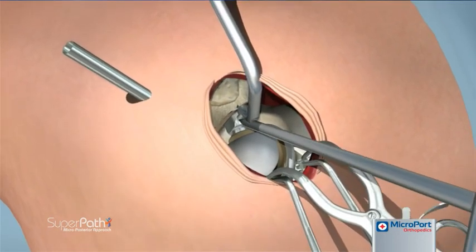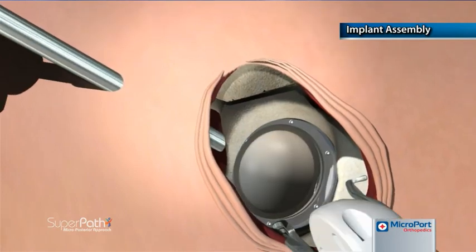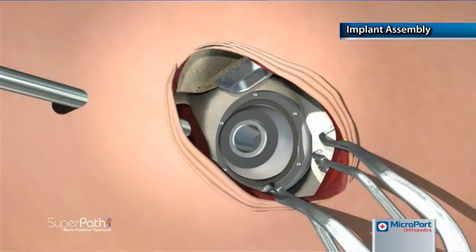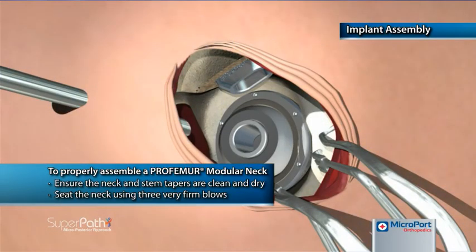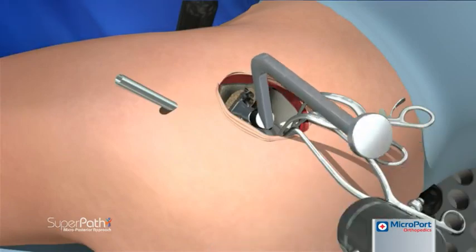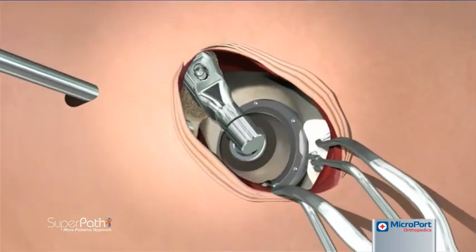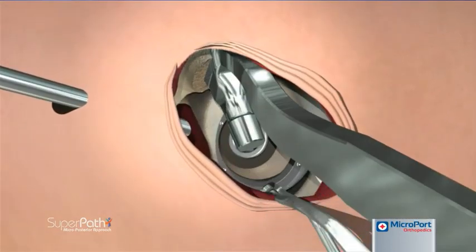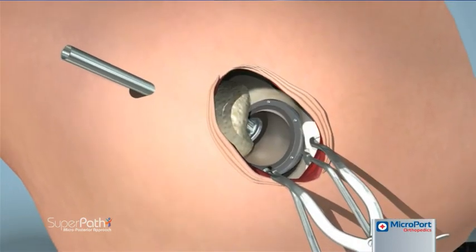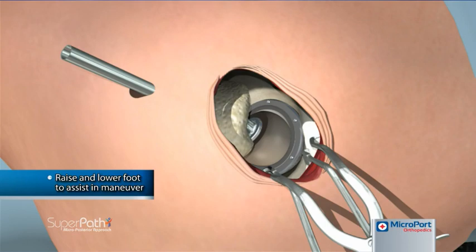The blunt trocar is inserted into the hole of the trial neck, and the bone hook and blunt trocar are leveraged against each other to disassemble the trial neck from the broach. After removing the broach, the femoral stem and acetabular cup implants are impacted into position. The femoral head implant is placed into the cup with the opening in a superior posterior position. The modular neck implant is then seated into the femoral stem and impacted firmly using the offset neck impactor. With the tip of the blunt trocar inserted into the top of the stem, the leg is translated to mate the femoral neck into the femoral head.